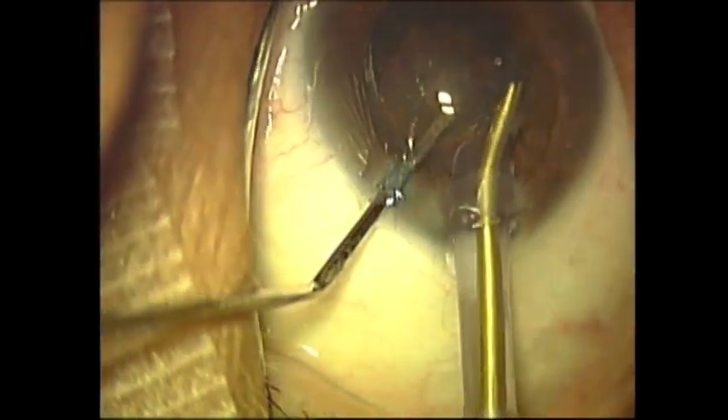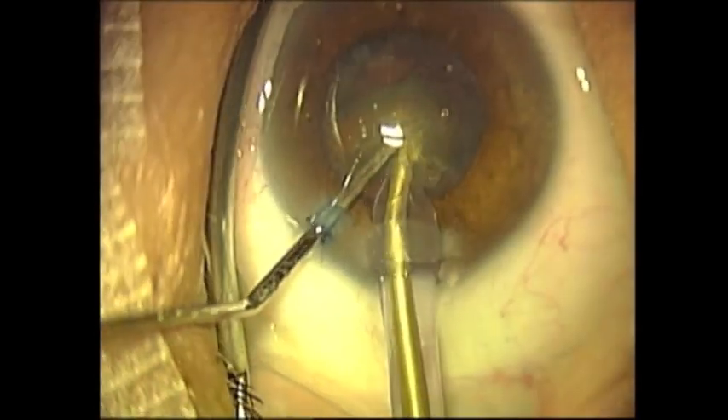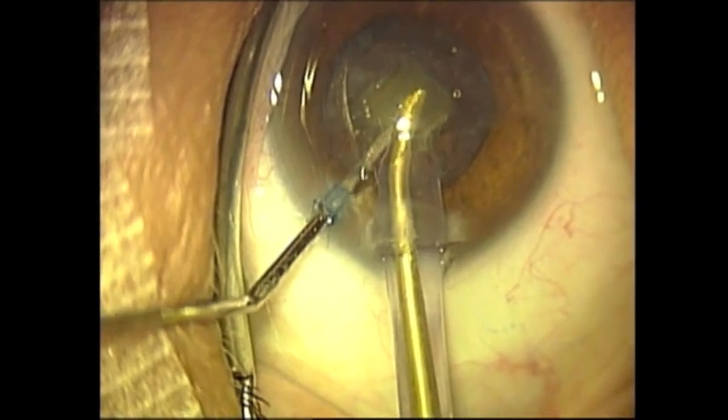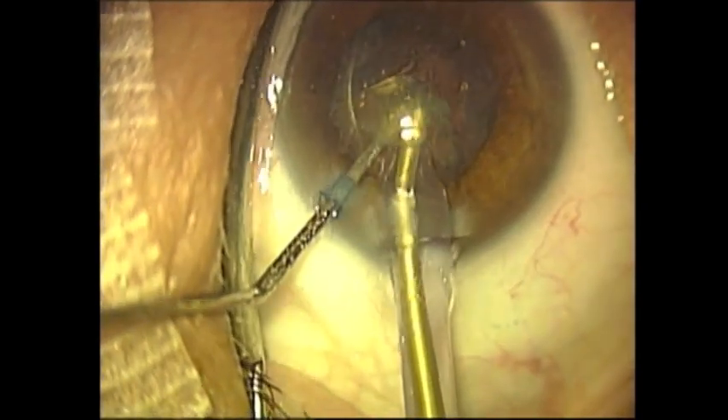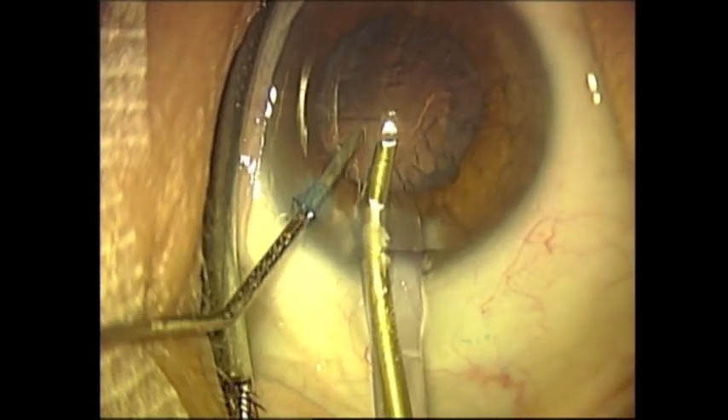Once the lens material has been completely phacoemulsified, this will leave only the cortical material to be aspirated. Once this is completed, the implant can then be inserted. This portion of the procedure is significantly safer with the Dewey Tip.